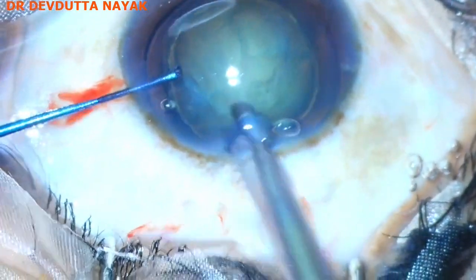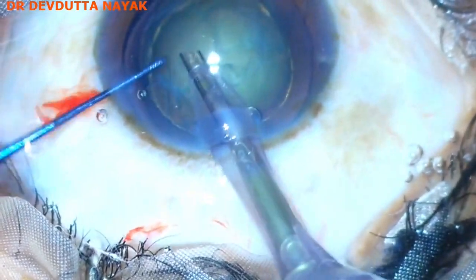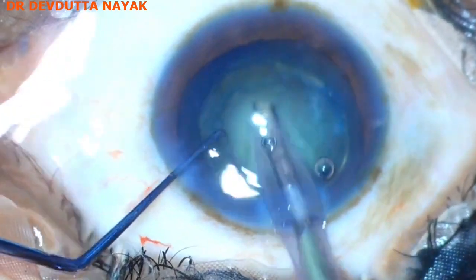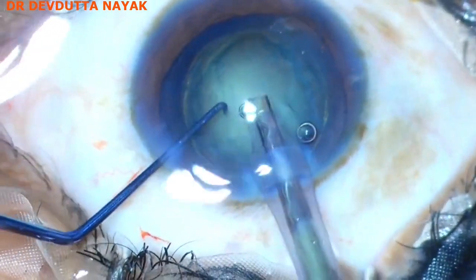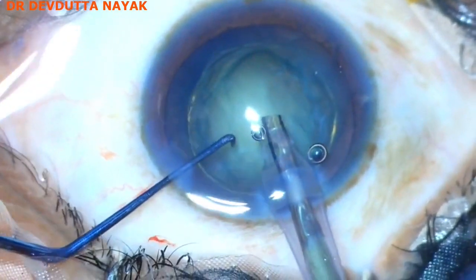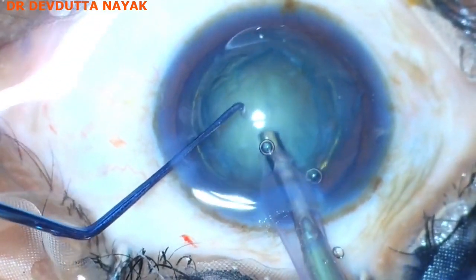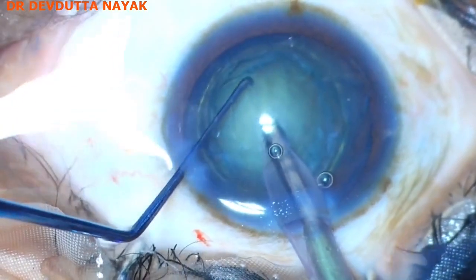We proceed to do the phacoemulsification part. First there is some sculpting, then we proceed to make a small trench and engage the nucleus with the help of the phaco probe.